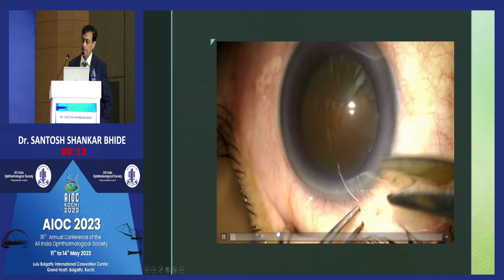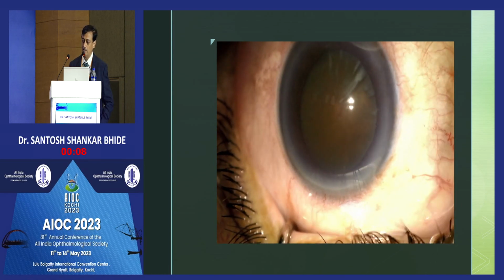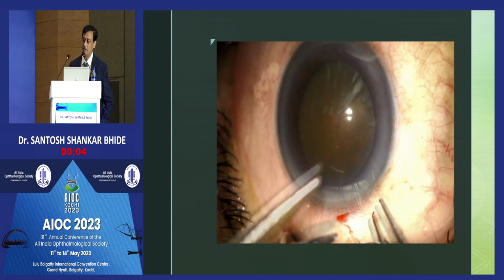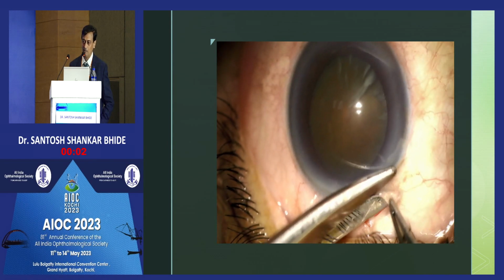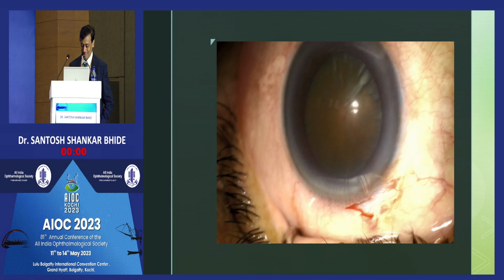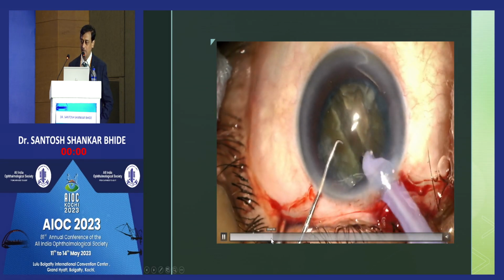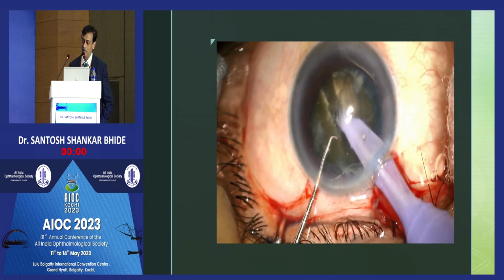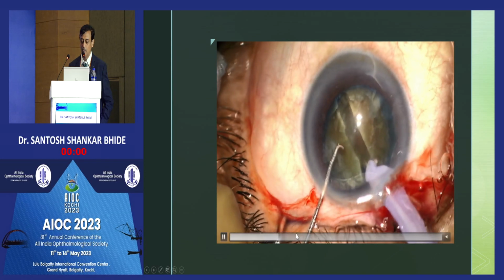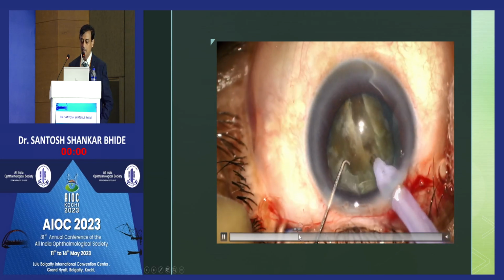I like to take a small conjunctival flap before, so as to avoid ballooning of the conjunctiva during phacoemulsification. I think this tip was given by K.K. Mehta sir in the initial stages, and you can also go posteriorly. Another thing is that you have to aspirate all the muck and the viscoelastic before starting phaco to avoid wound burns. Take a deep trench, rotate it.